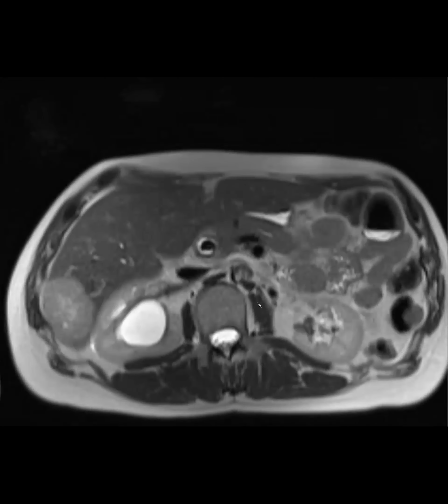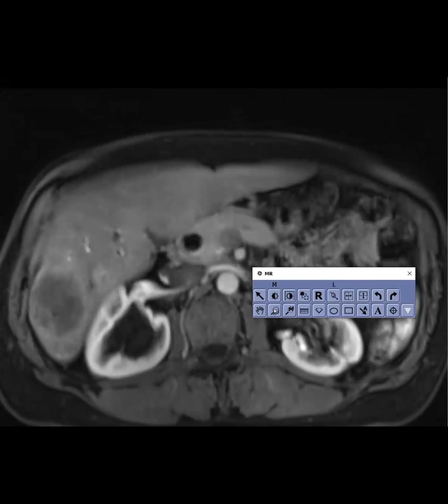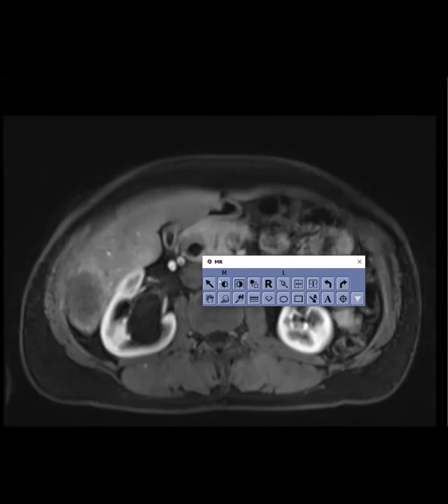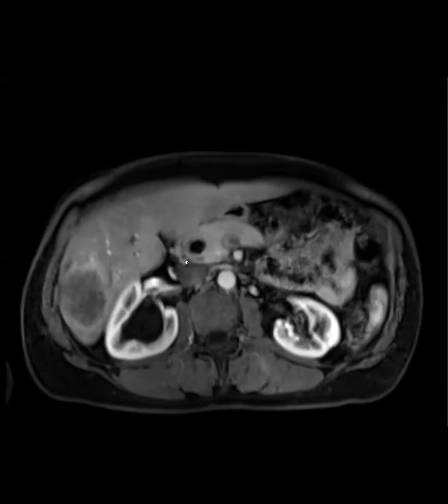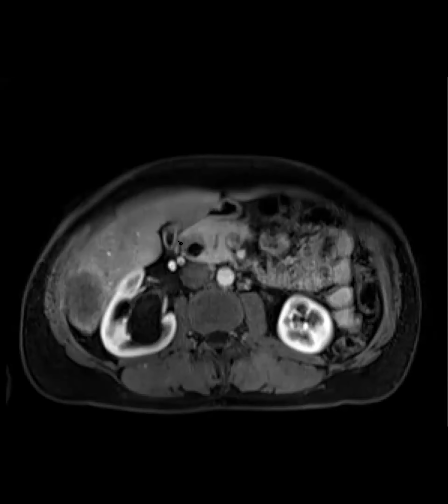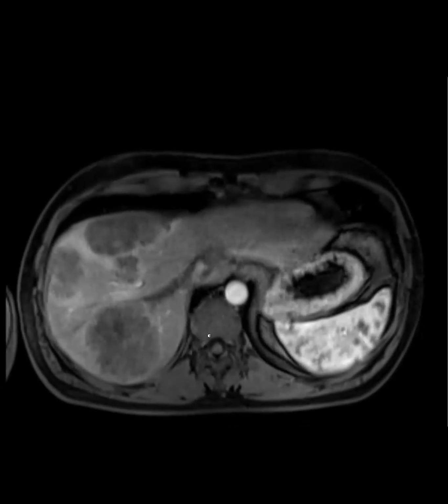And his tumor is very interesting. It's actually still in place, and it is this cuff here. This is biopsy proven pancreatic acinar cell. Acinar cell is usually, it actually predominates in the head, but it can be anywhere in the pancreas, but it's usually large, exophytic, and heterogeneous. More rarely, it's smaller, and even more rarely, it can cause biliary obstruction. In this case, I think it was a pretty aggressive one because this tumor has all of these liver mets.